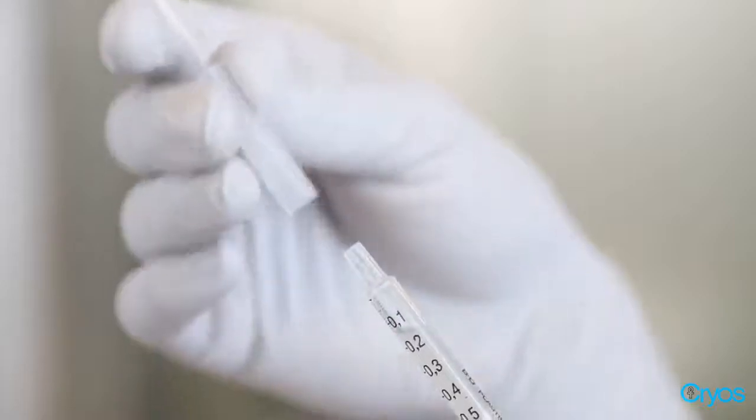However, if you're using 2 straws, draw the syringe to the 0.5 milliliter mark, stop, and then repeat for the second straw. There might be a little sperm left on the inner sides of the straws, but the combined volume of the 2 straws will be plenty of total sperm to provide a chance to obtain pregnancy. Other procedures conducted at fertility clinics such as IVF or intracytoplasmic sperm injection have increased chances to obtain a pregnancy due to the character of the insemination and fertilization.